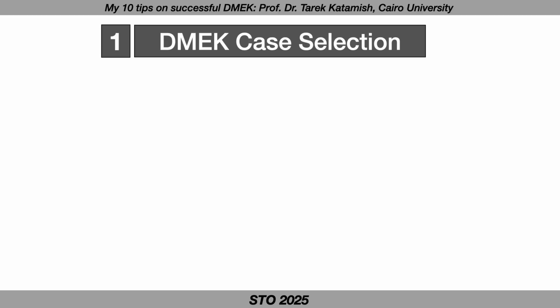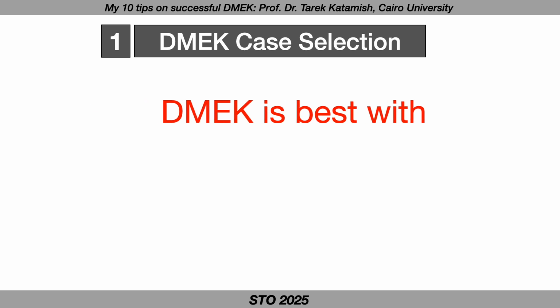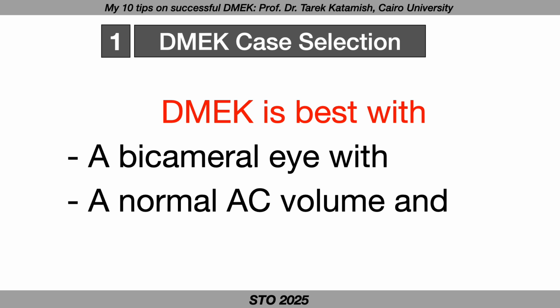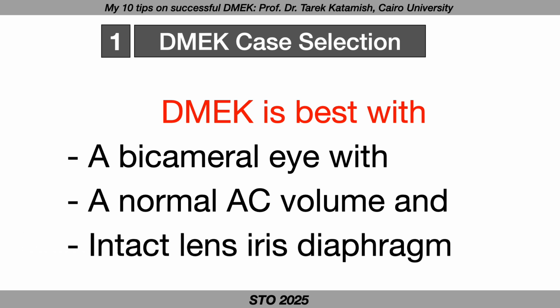Throughout these steps, we have a lot of tips. So in this talk, I will try to show my 10 tips for successful DMEK surgery. Tip number 1, DMEK case selection. DMEK is best with a bicameral eye with a normal anterior chamber volume and intact lens iris diaphragm.